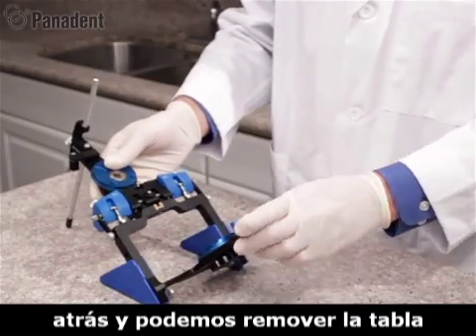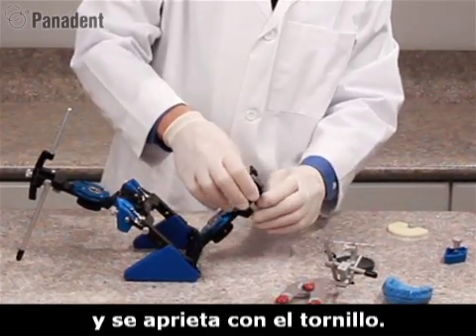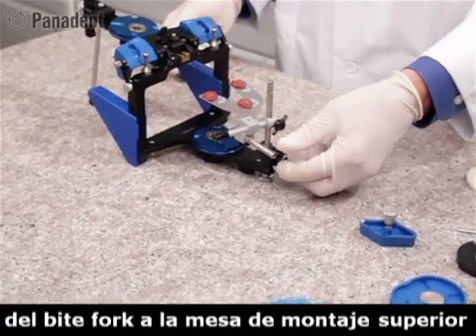We swing this back and remove the incisal table, replacing it with the mounting fixture which slides into place and tightens with the screw. We can now add our bifork assembly to the mounting fixture and tighten it into place.